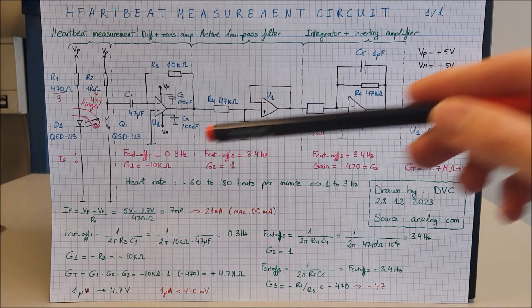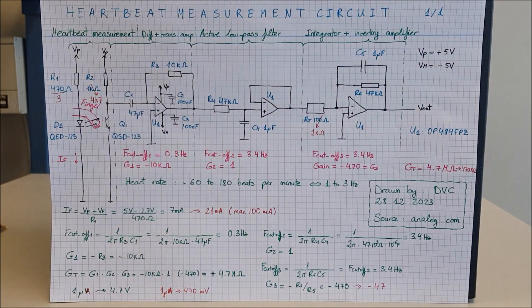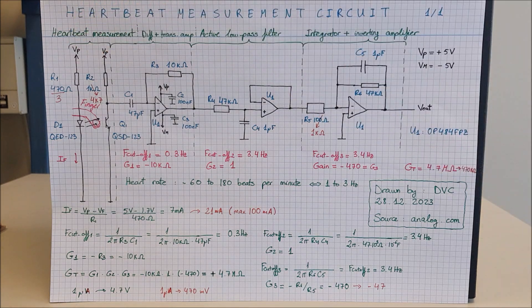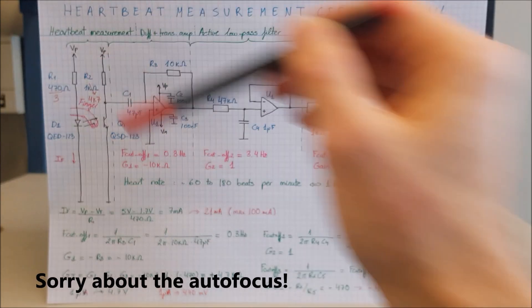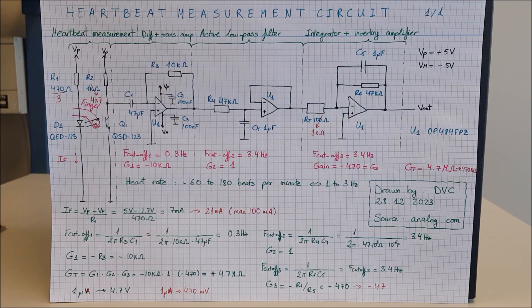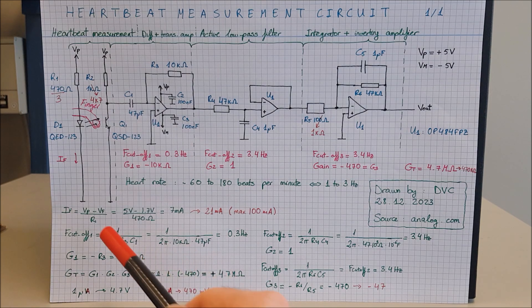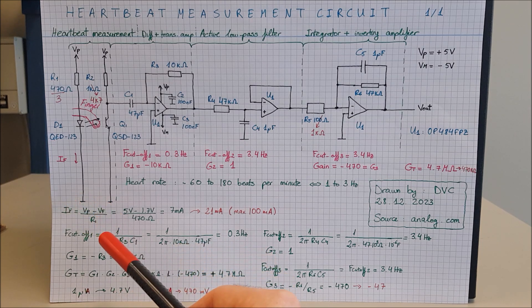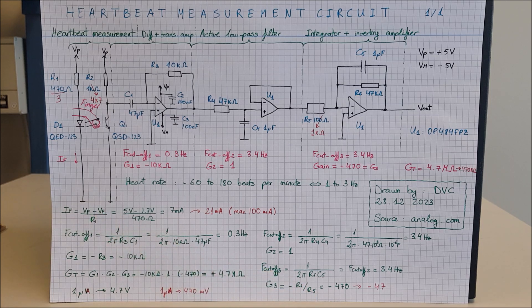We begin by limiting the current flowing through an infrared LED. Here we have plus 5 volts and resistor R1 is limiting the current so we don't destroy our LED. The forward current is given by this equation where we have 5 volts, the forward voltage of the LED, and the resistor.